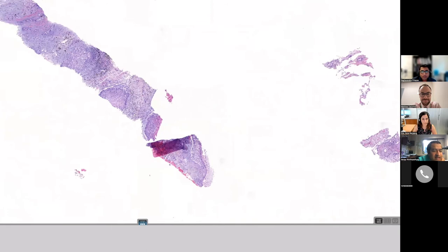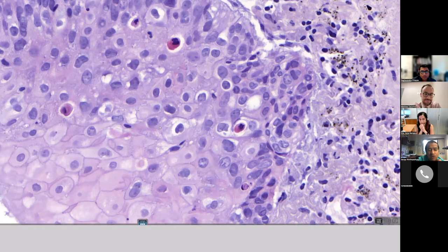I would say that for a beginner in lung pathology, it's important to know that unless it looks clearly squamous, which it does in some areas here, it's not a bad idea to do the stains, because solid things like this can also be solid adenocarcinoma. So that's really the decision you have to make. Is it clearly squamous on the H&E and you don't need stains? Or are you not sure, and then do the stains, TTF1 and P40? Because the differential here is a solid variant of adenocarcinoma. But like we discussed in this case, I think we are all on the same page that that's really not an issue here. Squamous carcinomas are P40 positive, all of them or almost all of them. So it's very few immunohistochemistry stains that you have to do to make this diagnosis quickly.